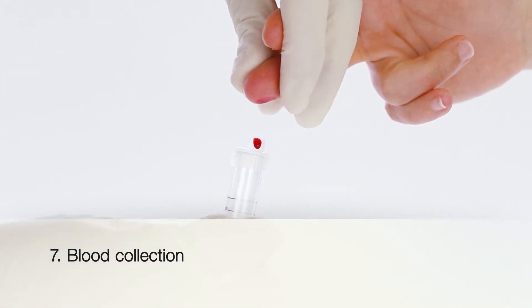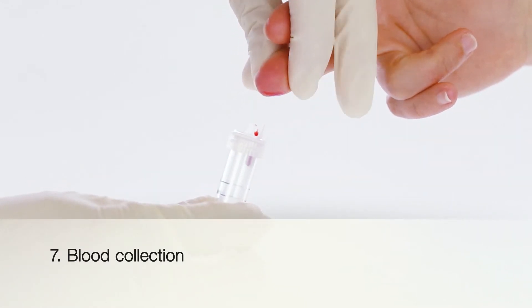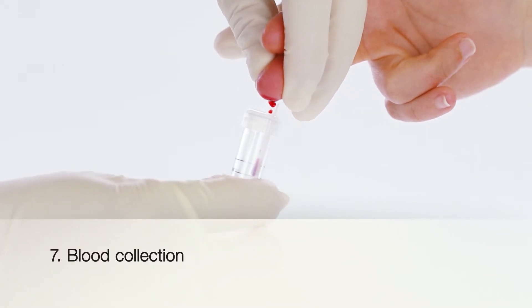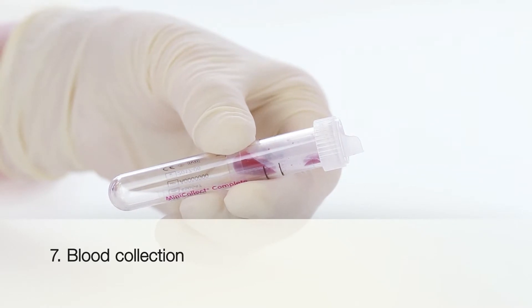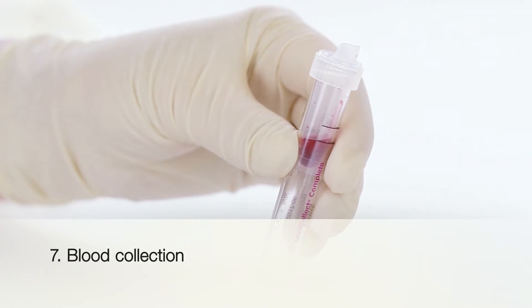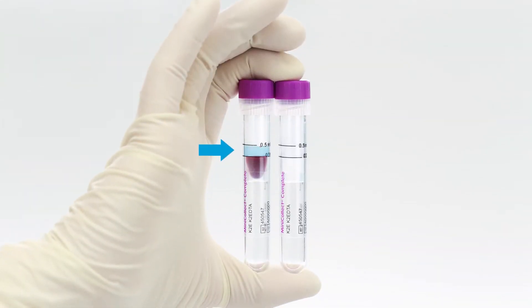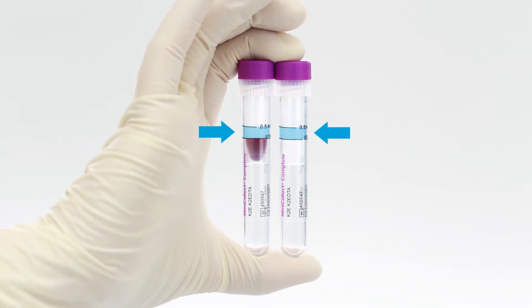The blood can be easily collected by holding the MiniCollect tube at an angle. You do not need any other equipment thanks to the integrated scoop. It may be wise to lightly move the tube around or gently tap it on a hard surface to release the droplet from the scoop. Fill the tube with the designated amount of blood to ensure an appropriate mixing ratio of additive to blood.